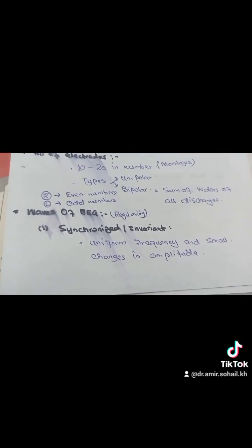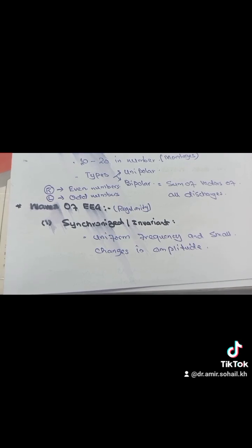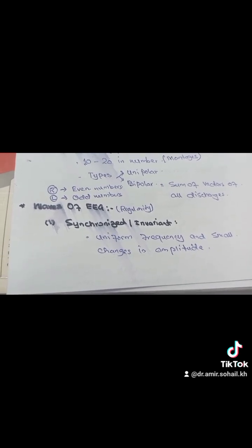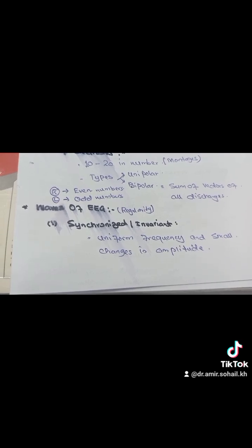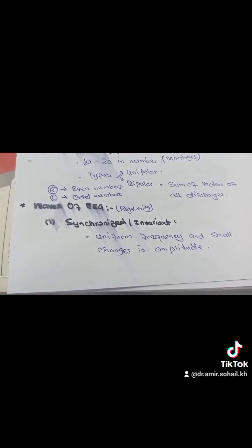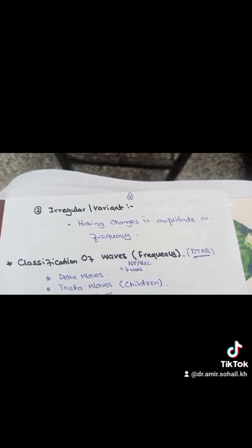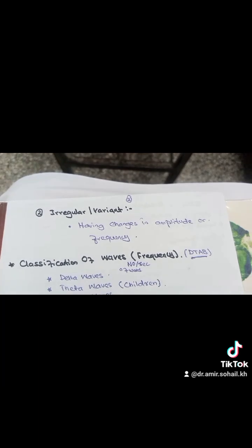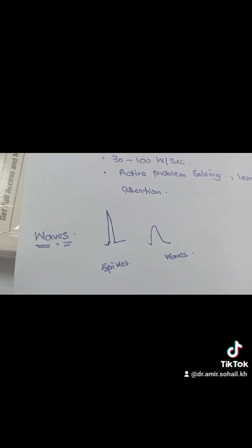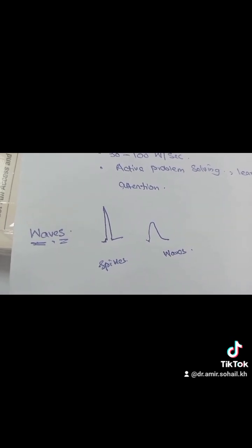On the basis of regularity of waves, there are two types of waves. One is synchronized or invariant waves, in which the waves are of uniform frequency and small changes in amplitude are seen. In irregular or variant waves, the waves have changes in amplitude, frequency or both. On the basis of morphology, waves are of two types, spike and waves.